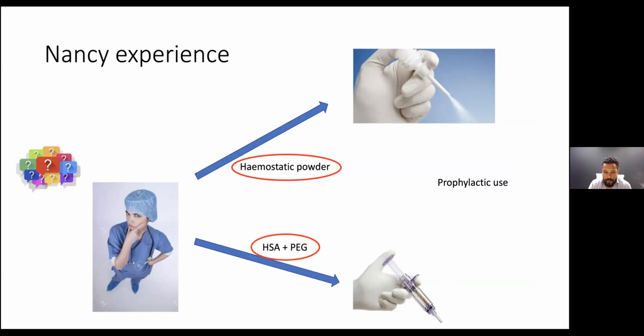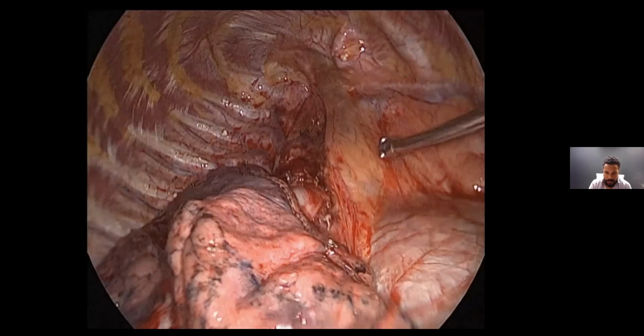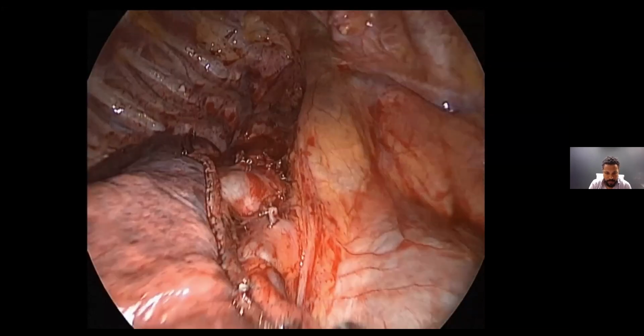The other reason why we don't use it only in specific patients is that there's not a strict correlation between the perioperative and the postoperative leak. And again, because of our situation, we can't keep patients in our hospital for many days, and we never discharge patients home with the chest tube. So here is a quick example of what we do.